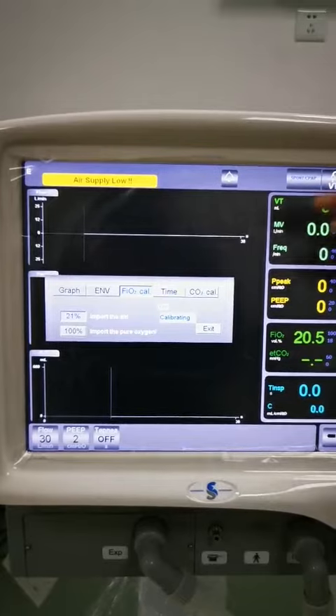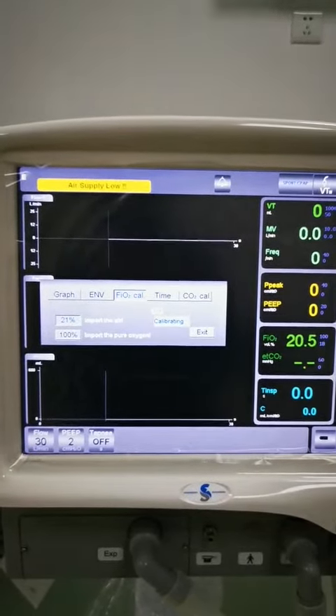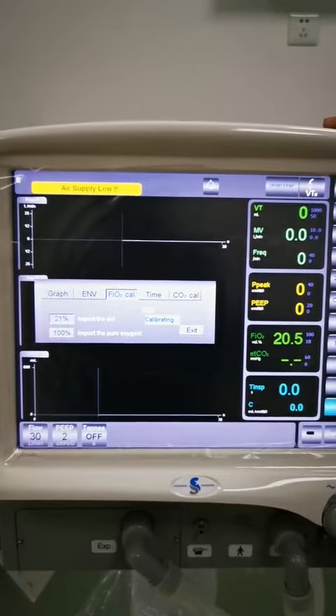When the calibration is finished, we will press the Exit button. Then the 21% oxygen concentration calibration will be complete.